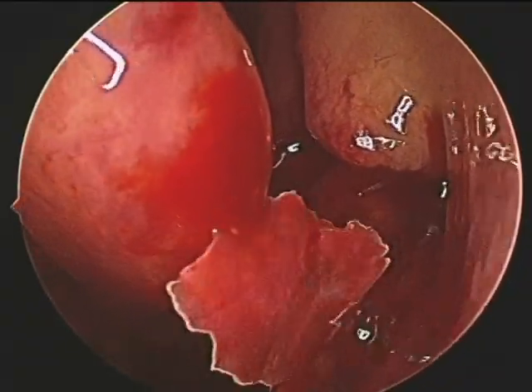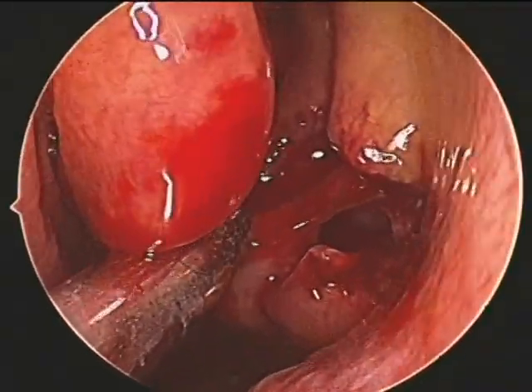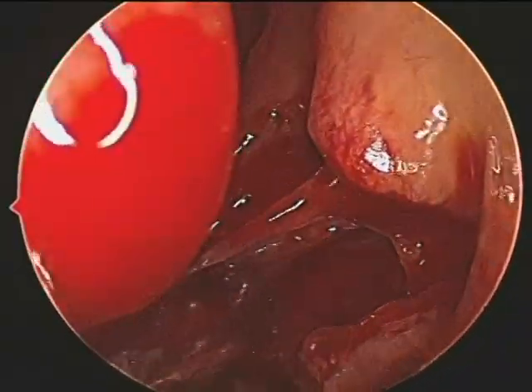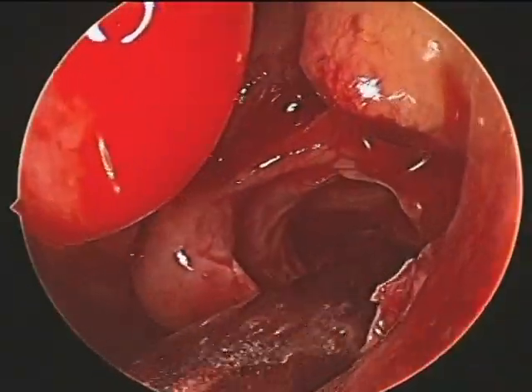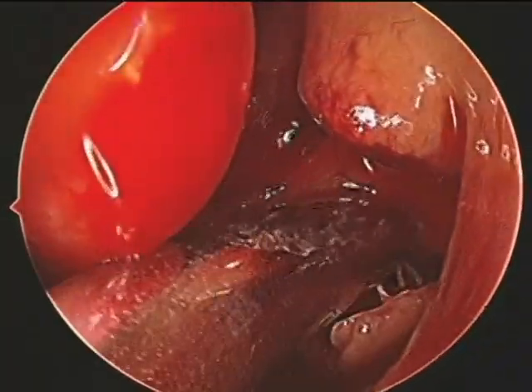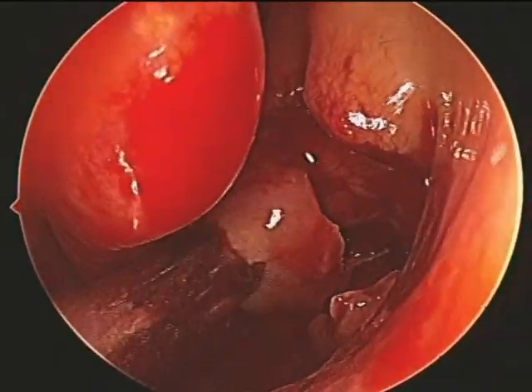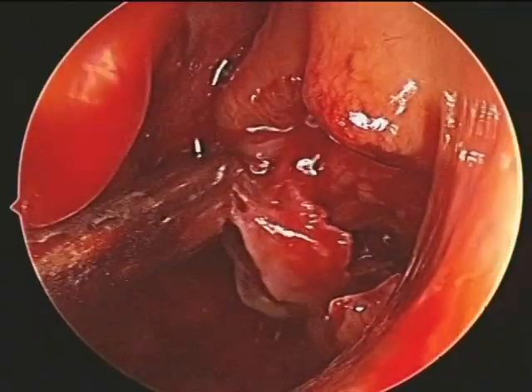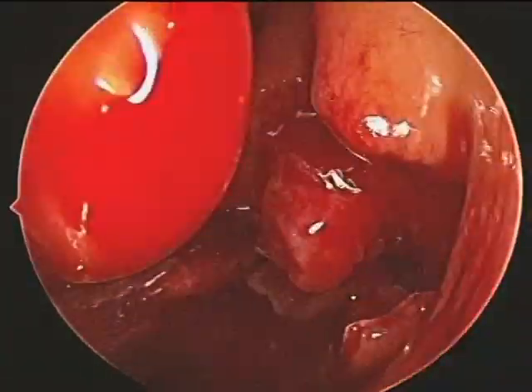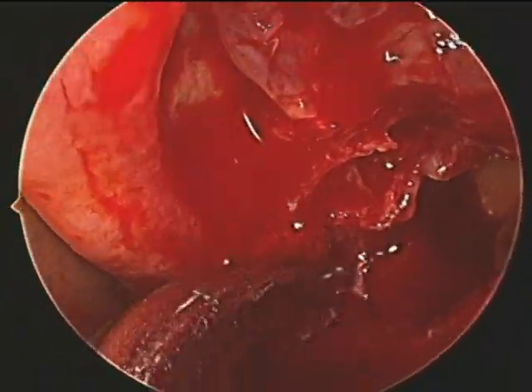This exposes the region of the infundibulum. We use a 45-degree Blakesley forceps to remove the bony chip from the horizontal portion, and a RAD 40 microdebrider to debride the remnants of the uncinate process. We can see the inferior medial border of the bulla ethmoidalis obstructing the region of the infundibulum, so we debride it to create adequate surgical space and a wide antrostomy.